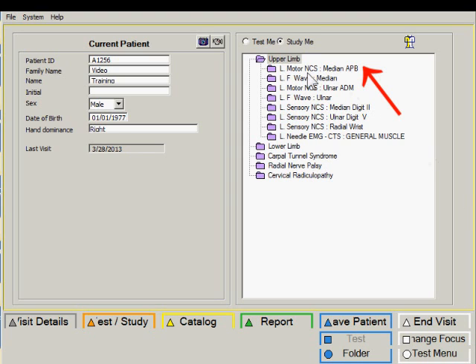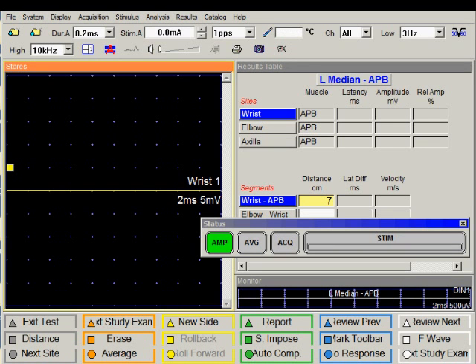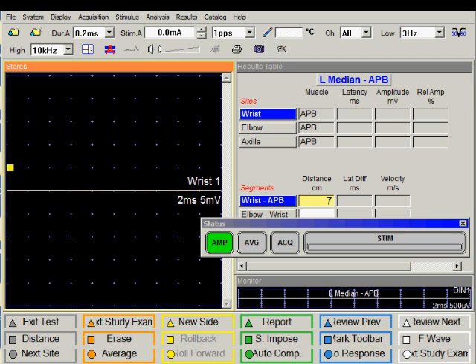We will begin by performing a motor nerve conduction study in the median nerve. As soon as I double clicked on that entry, I was immediately in that test. I did not have to select the side. I did not have to select the nerve. So by reducing the number of clicks or selections, the number of errors can be reduced.